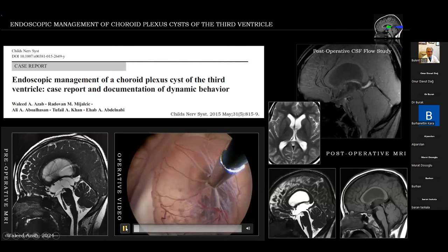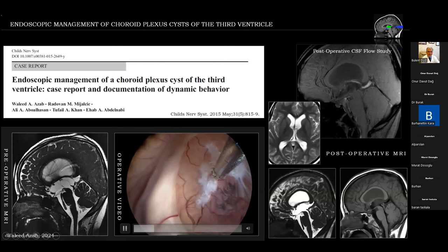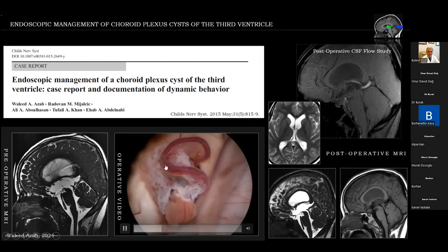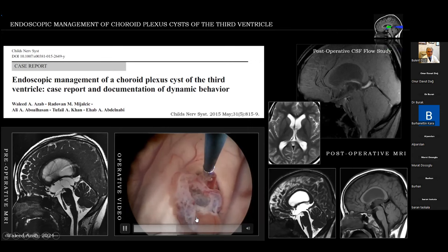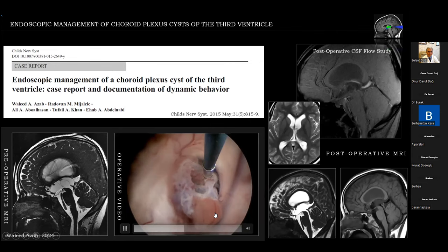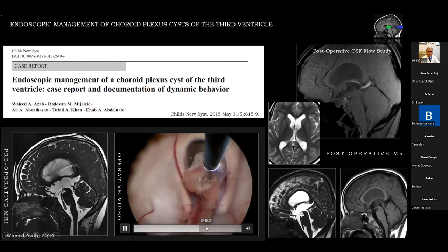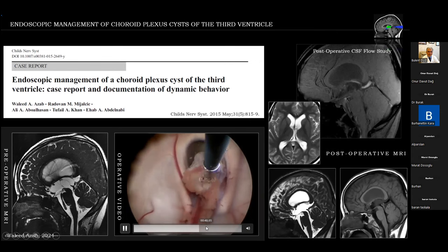Please observe how the cyst behaves — it kept moving throughout surgery. The cyst wall was ablated using the bipolar and coagulated. Then a hypertrophic choroidal vessel — one of the main feeders of the enlarged hypertrophic tissue — is seen. This is the main choroid plexus tissue in that patient. It was shrunken and completely taken down using the bipolar until the clear foramen of Monro was achieved.